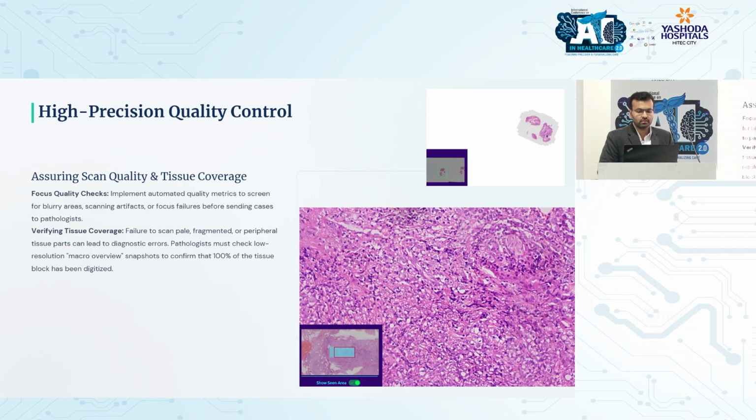For example, in this particular bit which you're seeing over there, a small bit is there at the periphery of the section. That might be missed when you're doing a completely automated scanning, right? But this image which you're seeing, the picture-in-picture image, is actually a macroscopic photo of your slide. So you can see that and decide whether everything is there or not there.